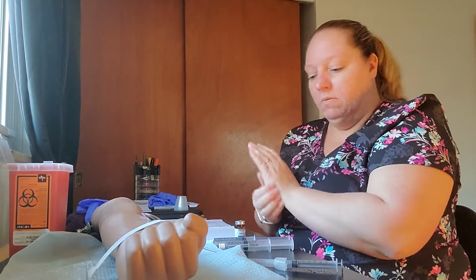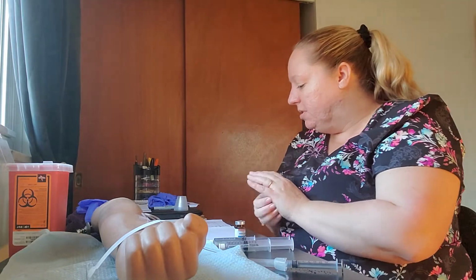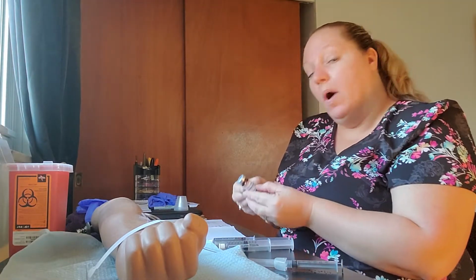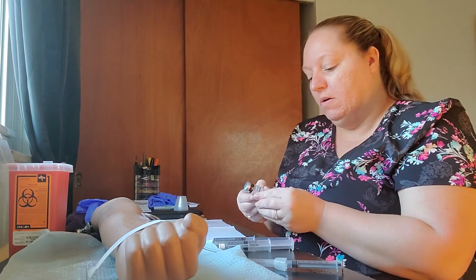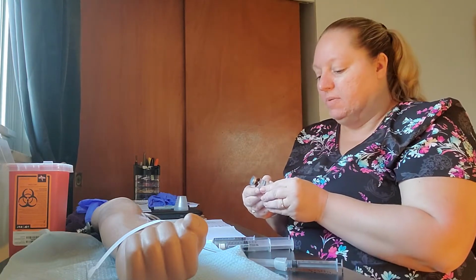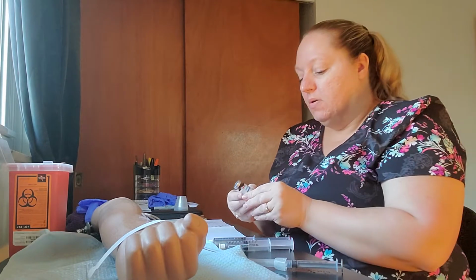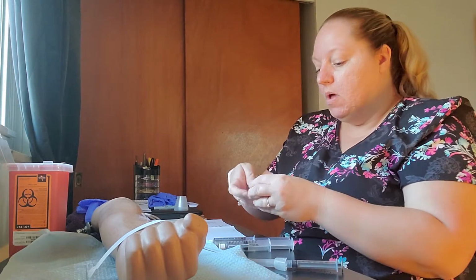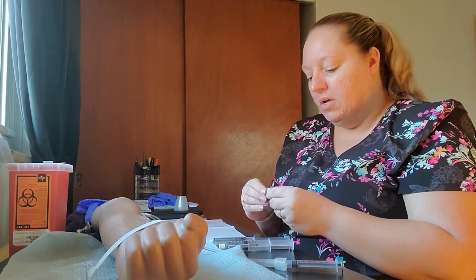I have the right medication. I have the right dose. I have the right time, the right patient, and the right route. My patient is Mary Edwards. The drug is bumetanide. It's 1 milligram per 4 milliliters, or 0.25 milligrams per mil. So that means I need 0.5 milligrams, making it 2 milliliters. The expiration date on this is 4/2027, so it's good to use.